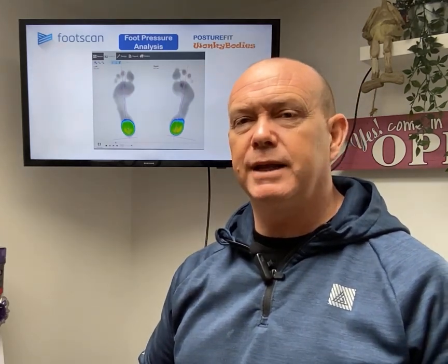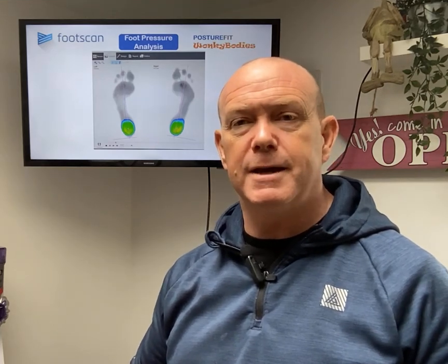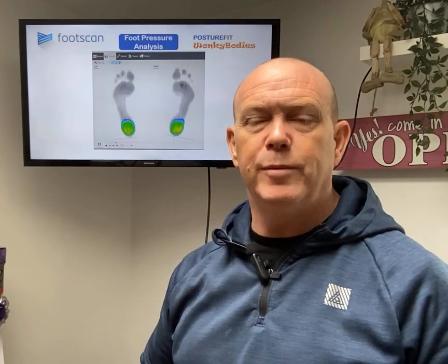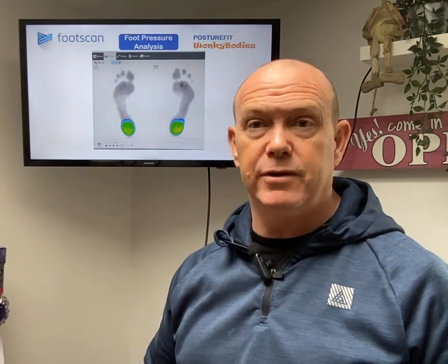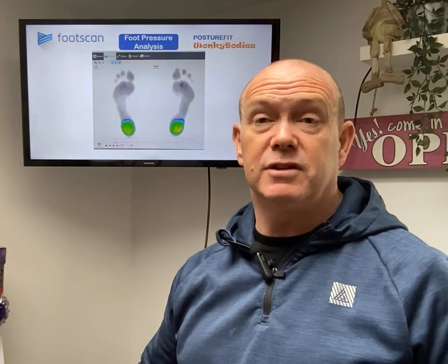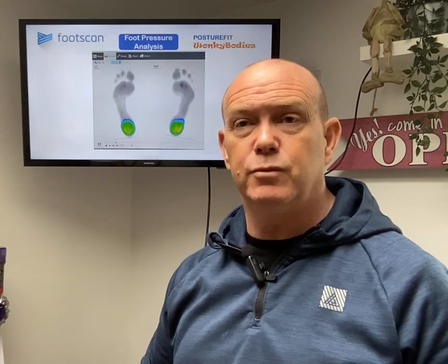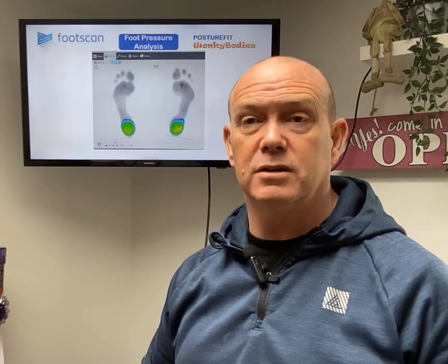So we've had a couple of people in clinic, new patients this week, both presenting with heel pain in their left heel. Now, when we looked at their injury and physical experience history, it wasn't particularly similar, but for some reason they've both been presenting with this heel problem. And there was no obvious incident which they recall the heel pain starting.